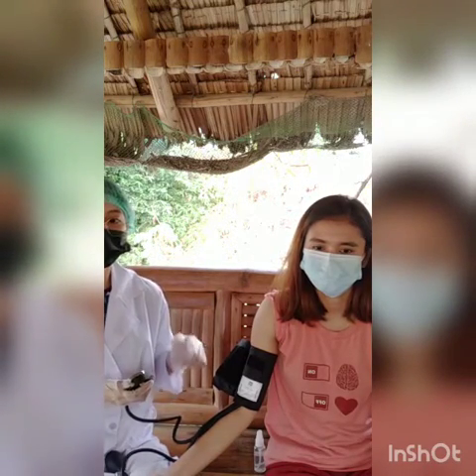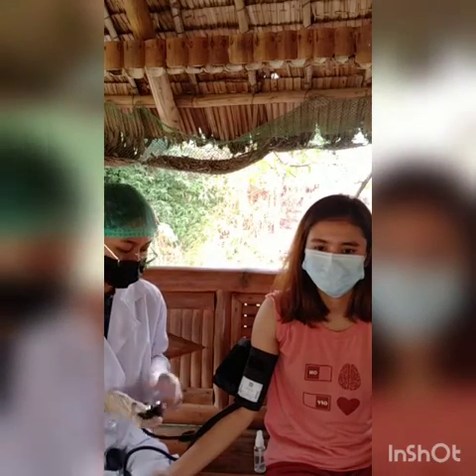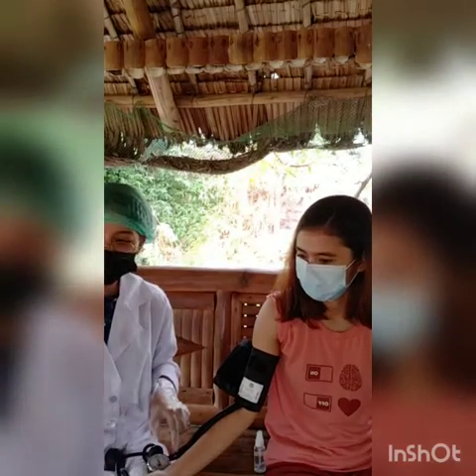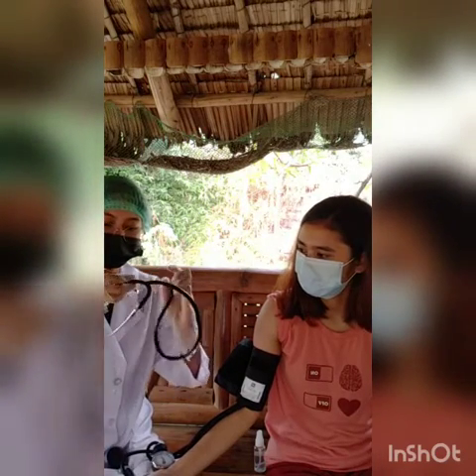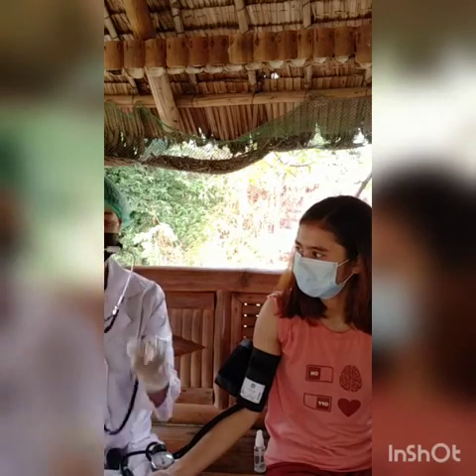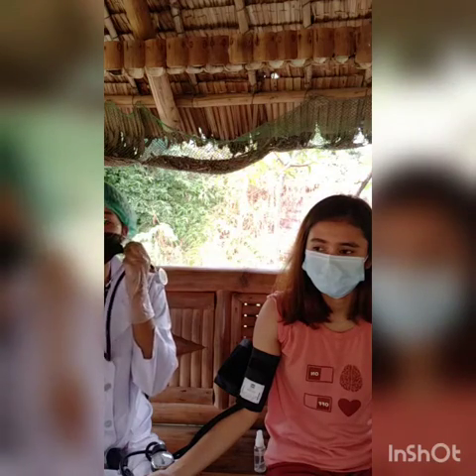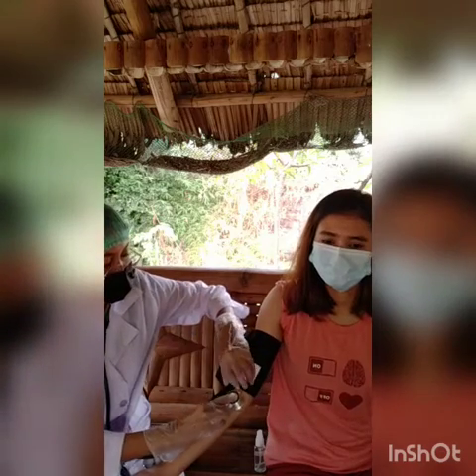And then after that, place the stethoscope earpieces in your ears, direct the earpieces forward into the canal and not against the ear itself. So, I have here my stethoscope. And place dito sa may pulso niya.